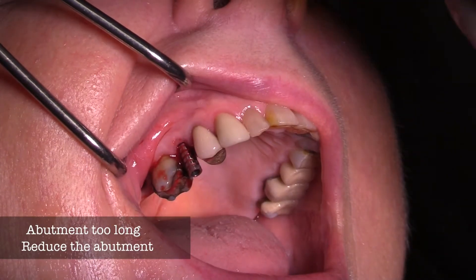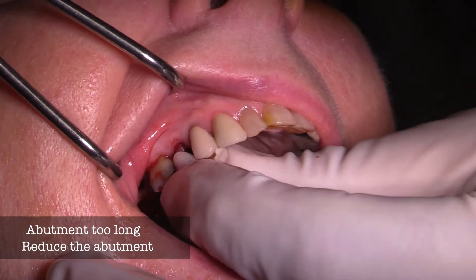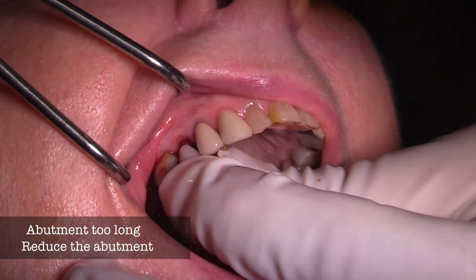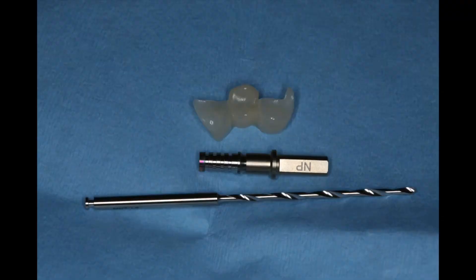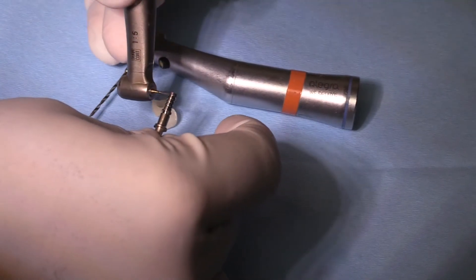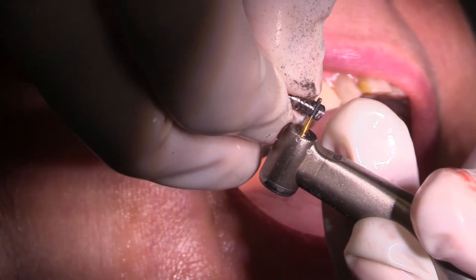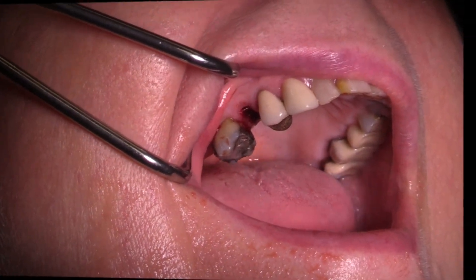We have to reduce the abutment because it's a bit too long. It's important for the surgeon placing this abutment to use the CC bone mill, which will enable it to not be bound by bone when seating. Also, when putting the temshell on top of the abutment, we have to cut a couple of the rings off on an analog specially designed for this. Cutting the rings will generate a little titanium dust, so clean it off using chlorhexidine.